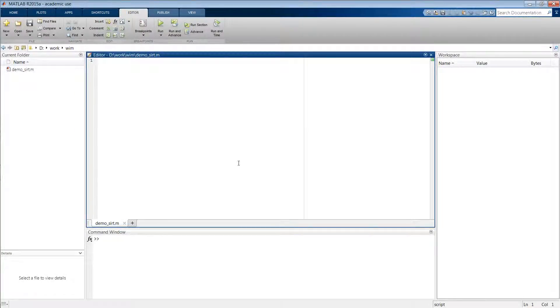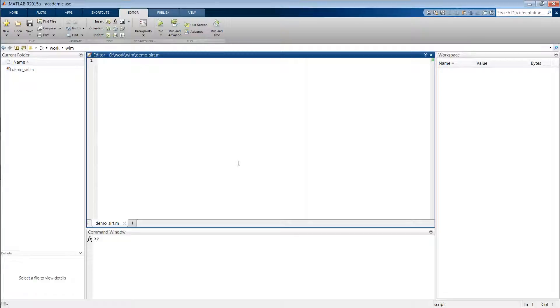In this video we'll give a demo on how to use and configure the SIRT algorithm in the ASTRA Toolbox. We'll do this by working out an example in which we'll first simulate some projection data of a Shepp-Logan phantom, and then use this projection data to reconstruct with the SIRT algorithm.